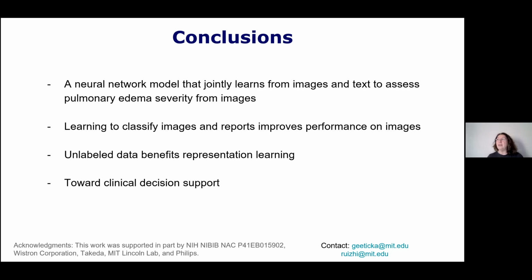And so the efforts that I know about, well, there are several different subfields of medical imaging that have it easier or harder. For example, in some fields like mammography, the label that we would want to get out of the images is recorded as part of the clinical practice. I told you in this talk that we are working with data where the radiologist wrote the description down.